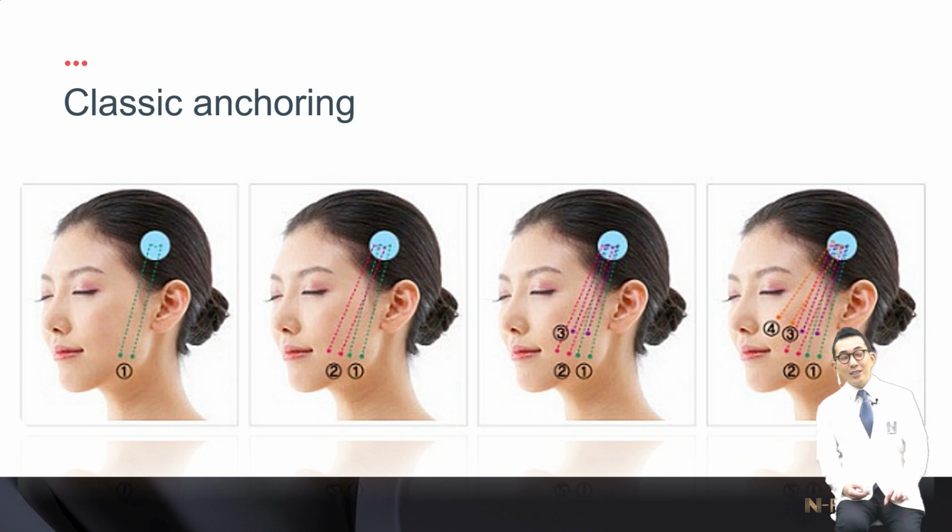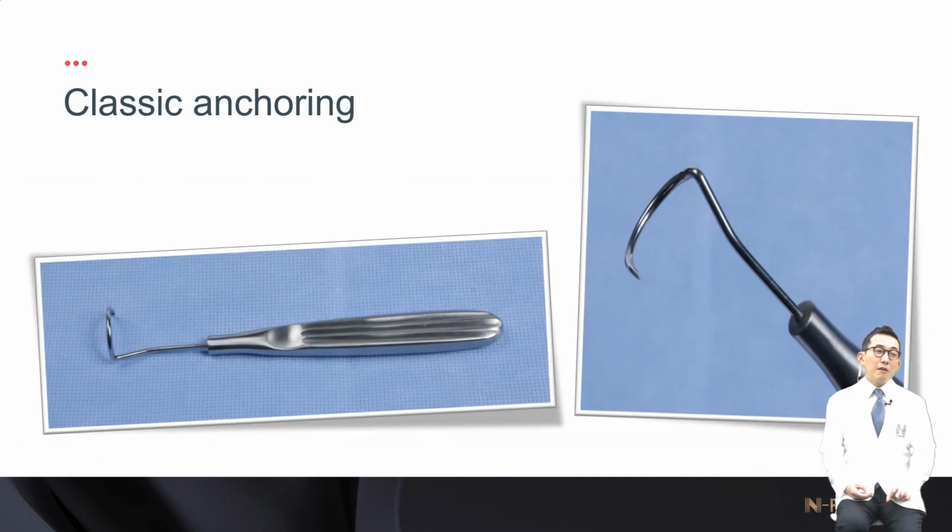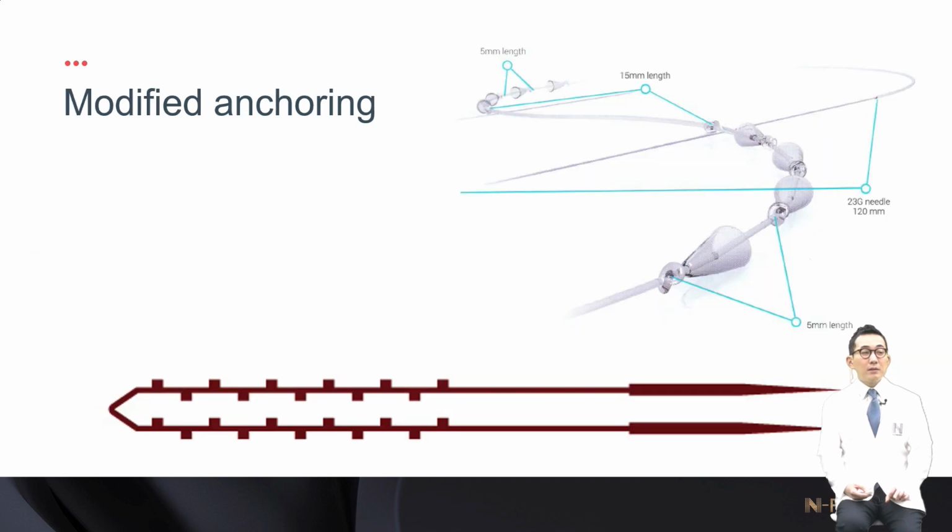Actually, I still like easy lift. The effect is strong and awesome. However, it is very surgically invasive. In order to anchor deeply, I have to use a temporal needle like this. After the procedure, the swelling also lasts quite a while.